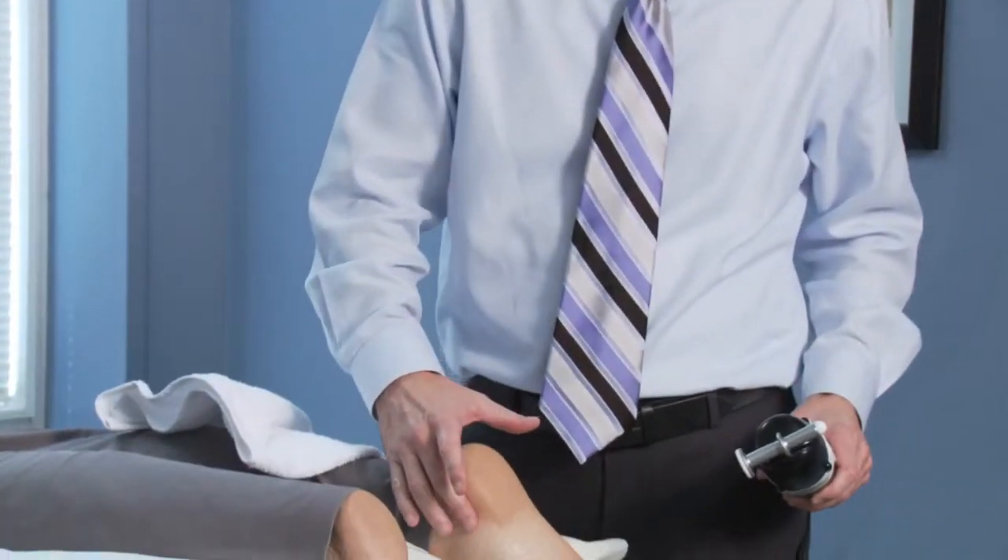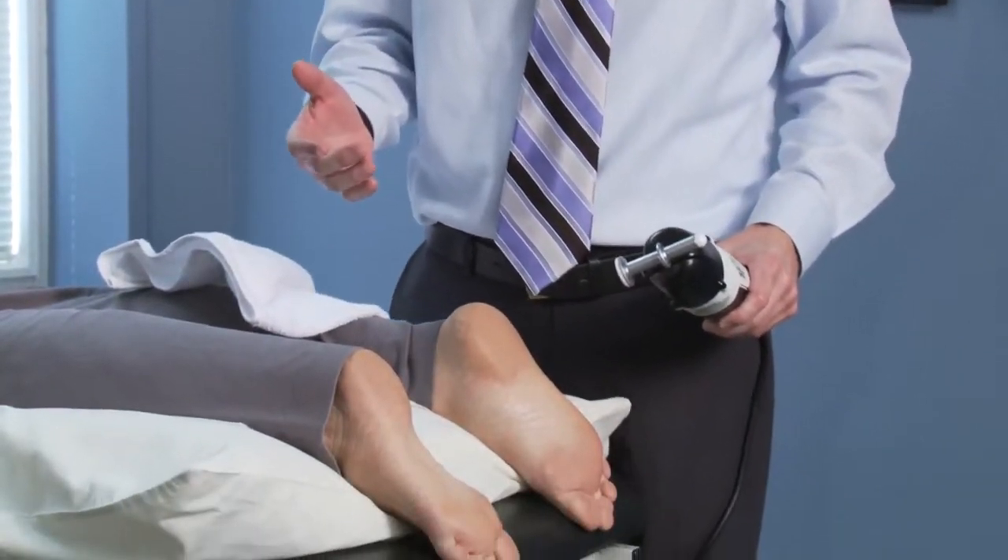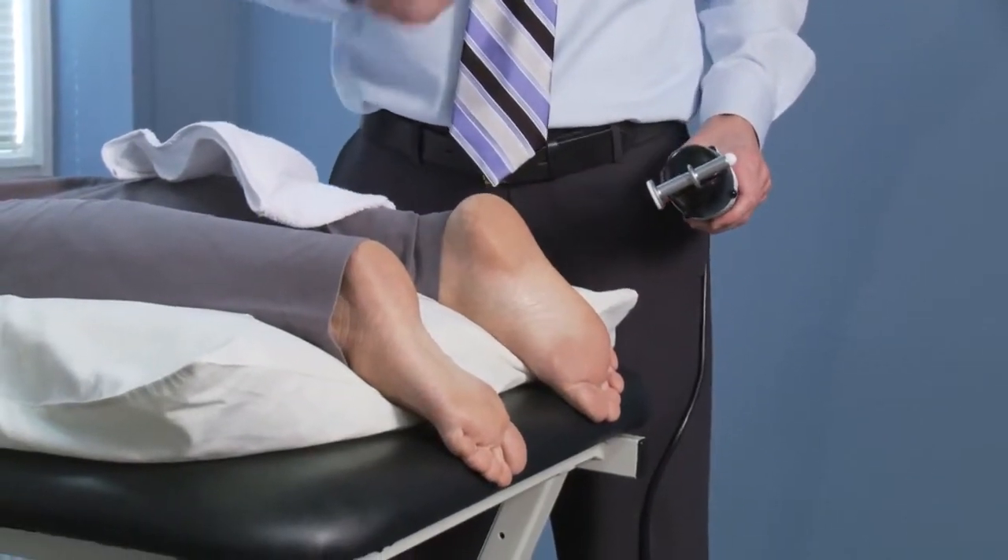Hi there, today I'd like to talk about a plantar fasciitis protocol using rapid release therapy. As many of you are aware, the plantar fascia can be kind of a sensitive area for patients using targeted high frequency vibration.